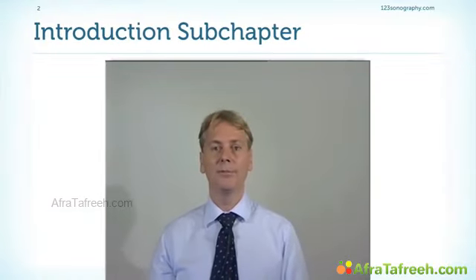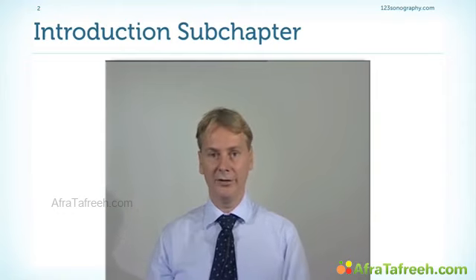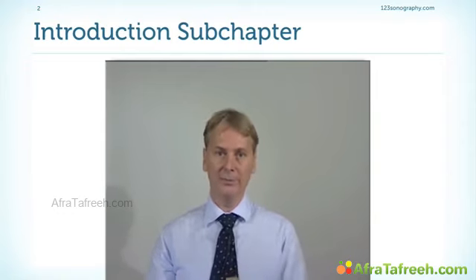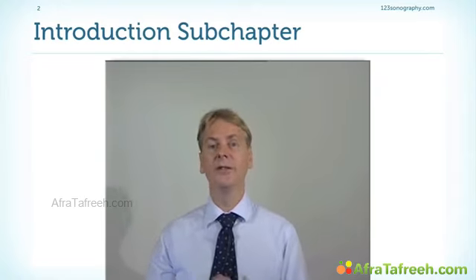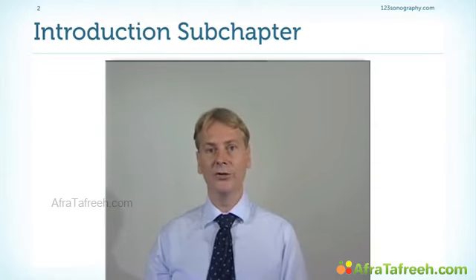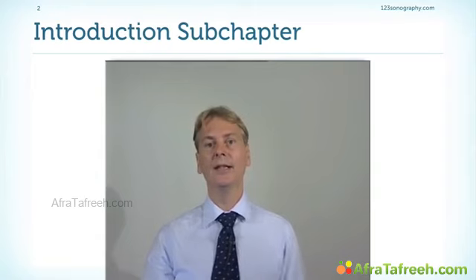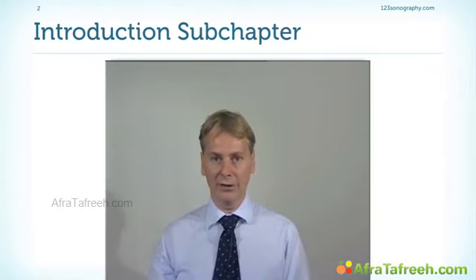I believe Doppler is such an important part of every routine exam. You should perform Doppler, of course, in every patient. And you can use pulsed-wave Doppler, continuous wave Doppler, color Doppler, and even tissue Doppler. In the following slides, I would like to show you where you would use which technique, what is part of a routine exam, what the normal measurements are, and what information you can get out of Doppler.